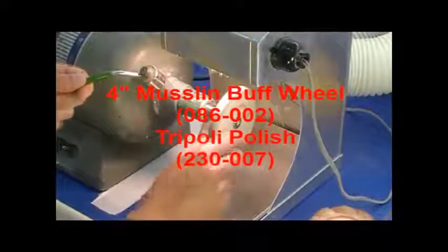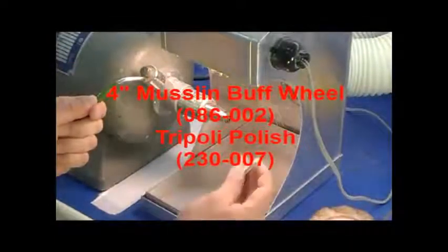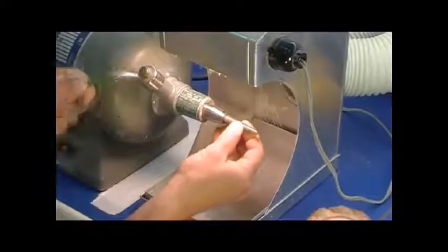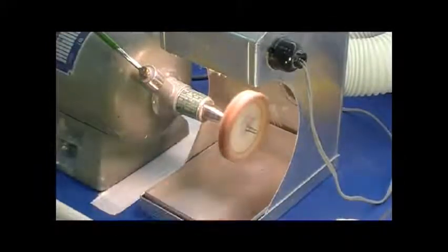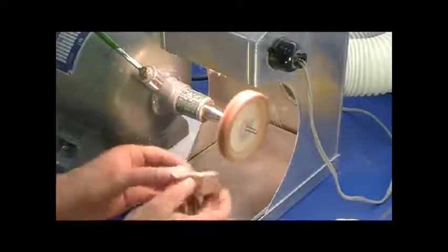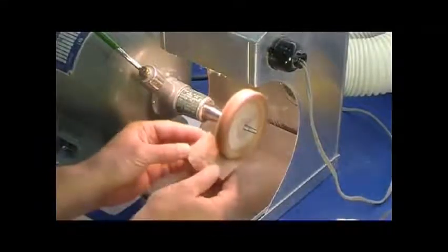Place a 4-inch loose muslin buff onto the threaded chuck on the low-speed quick chuck lathe. Apply Tripoli polish to the wheel. This coarse polish removes fine scratches left behind from pumicing. Press the appliance lightly against the wheel to apply the Tripoli polish.